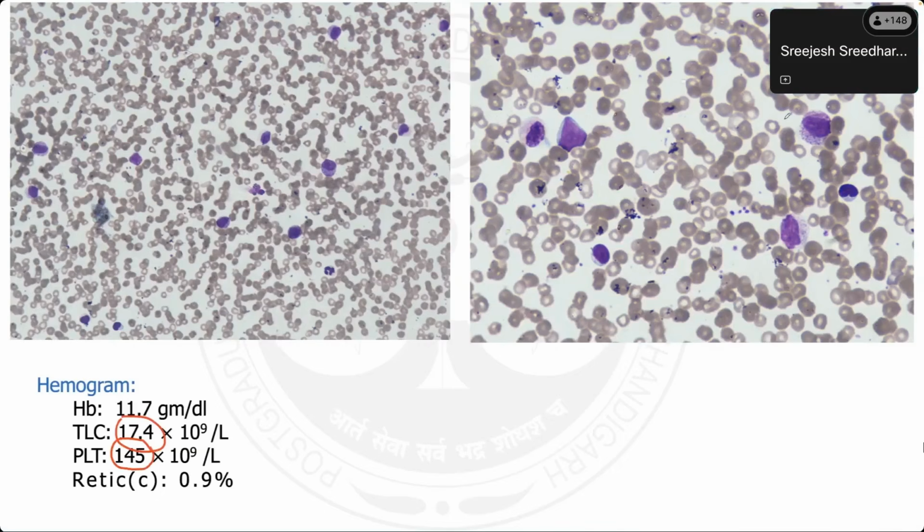And you see this, very few neutrophils, only occasional neutrophils and an occasional blastoid cell. The majority of the cells were like this. Confusion, right? It is very difficult to say straightforwardly whether they are blasts or promyelocytes.